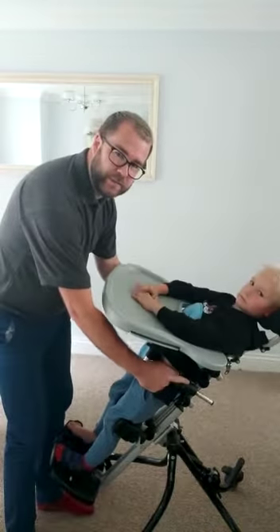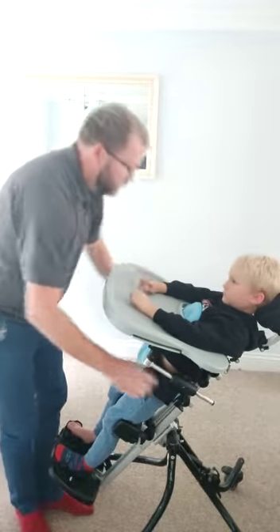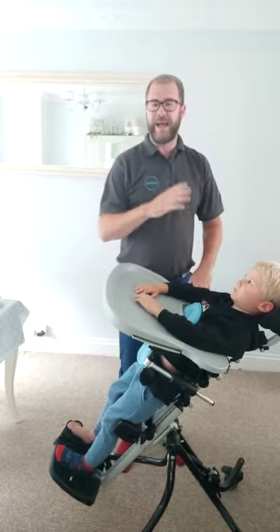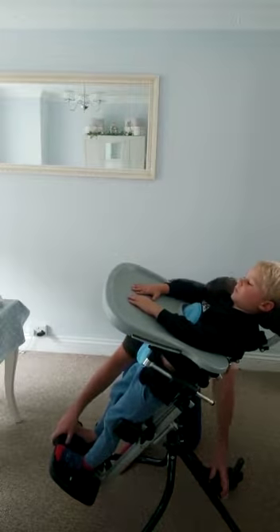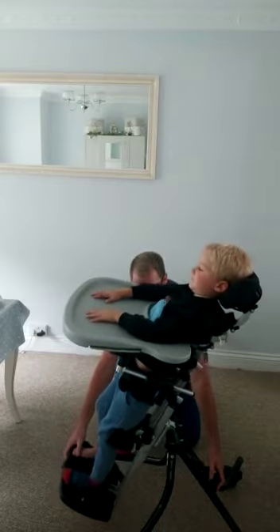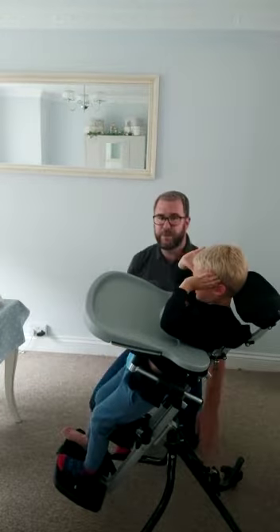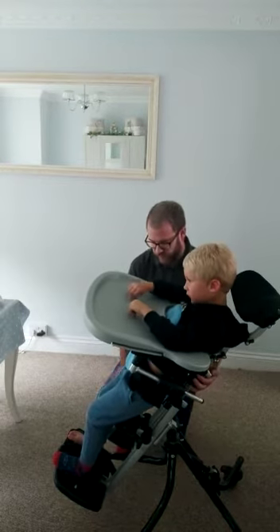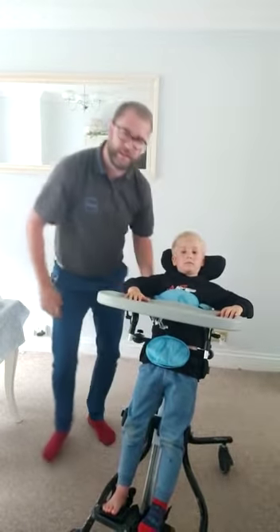That's when I like to put the tray on — when we're around halfway up. Arms up Maxi — tray goes on and you've got some little thumb screws on this side and the other side, tighten those up. Then depending on what your physio has said, you'll come up to say 80 degrees, 70 degrees, or 65 degrees. Pull that pin out again and up we come — then you'll stop in any position that you like. Please remember to lock that pin off like so. Straight legs — and that's it for the squiggle stander, thank you, bye bye!